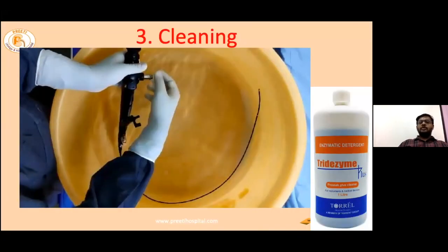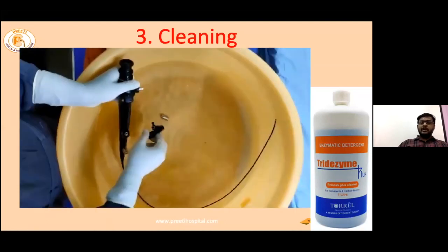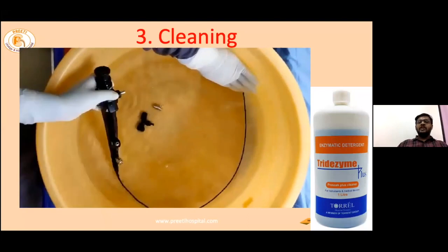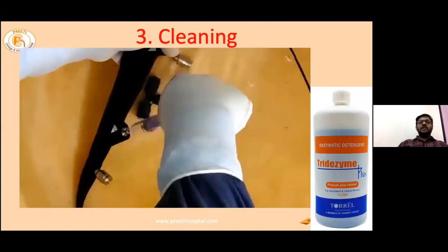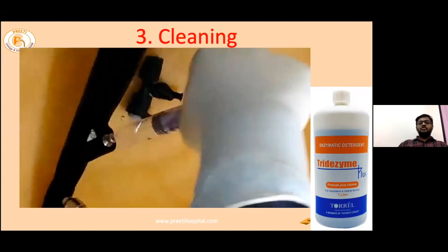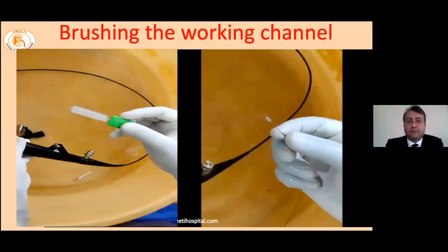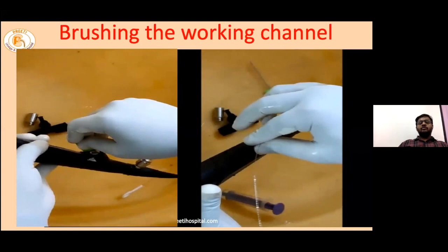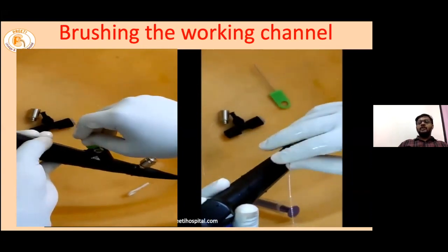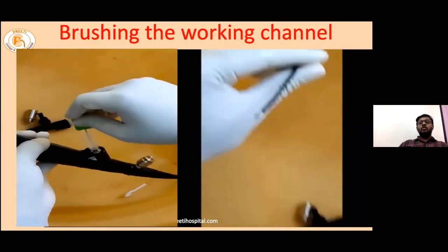When the scope is leak test positive, it goes for repair. When the leak test is negative, we take the scope for further cleaning. In this cleaning, the scope is cleaned both interior and exterior with enzymatic solutions. Using a 10 ml or 20 ml syringe, the channels are flushed so that all debris inside is washed out. Manufacturers also provide various shapes and sizes of brushes to clean all the valves and channels, which is important before proceeding to disinfection.